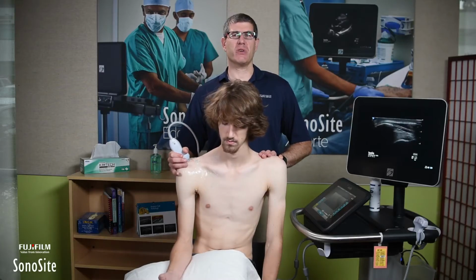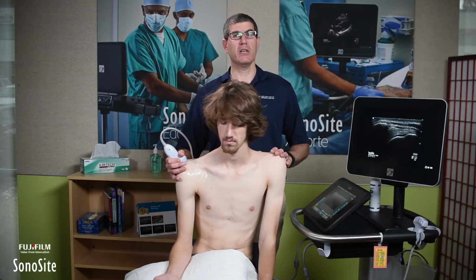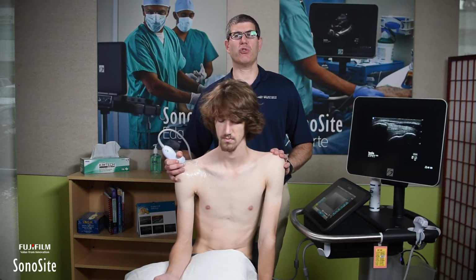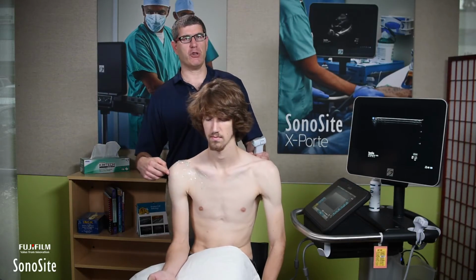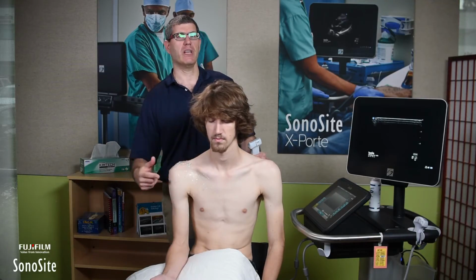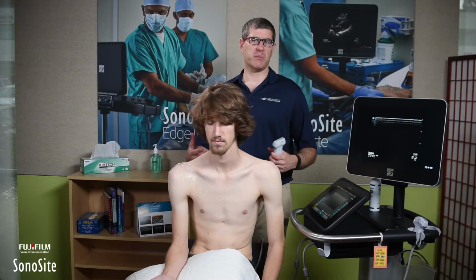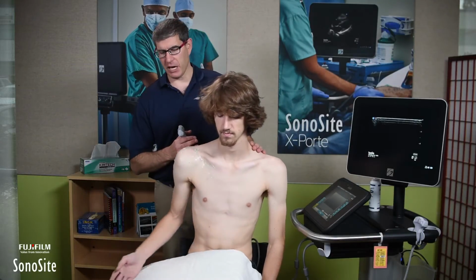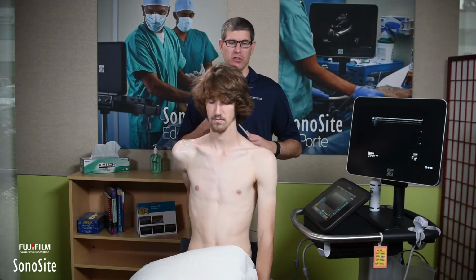Now, one of the problems here is I can't really see a lot of the anatomy more medially. So what I really need to do is put the shoulder into a position so that the greater tuberosity is going to be rotated. I want to bring it forward. There's a couple different ways to do that, but in this case, I'm going to go into what's called a modified Crass position. And Jacob, if you'd be kind enough to put your right hand like you're going into a back pocket, then sit up fairly tall.